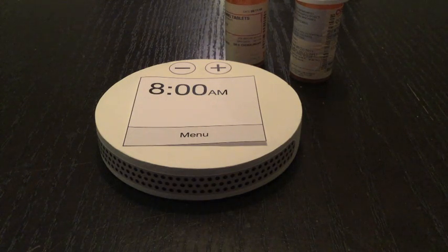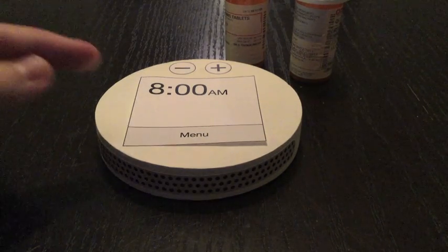The user wants to make sure that they are receiving their medication at a specified time. Their main concern is forgetting to take their pills. There is an alert that reminds the user that is displayed audibly, visually, and also tactilely in the sense that the device vibrates. The first step is that the user would touch the menu button on the main screen.